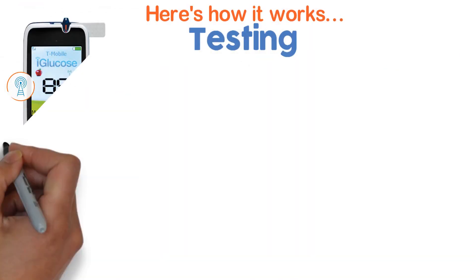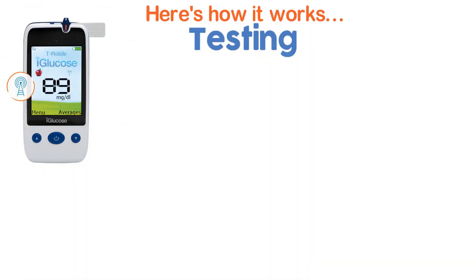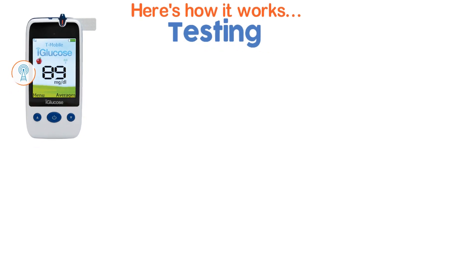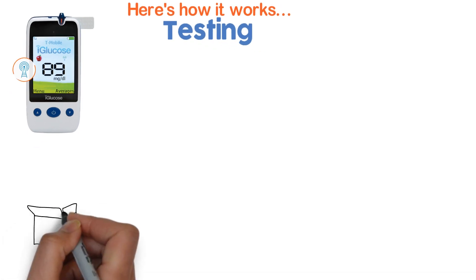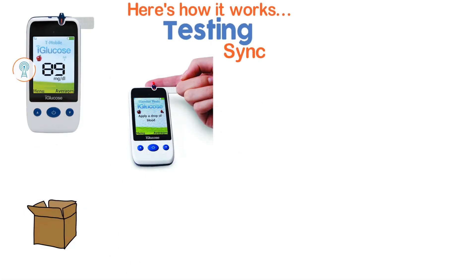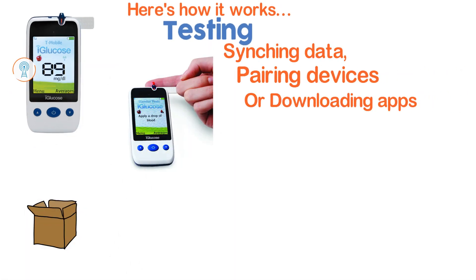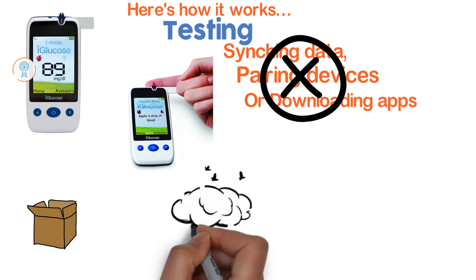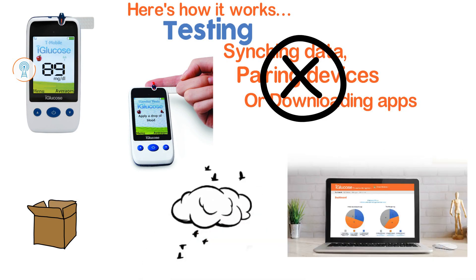You use a cell-enabled iGlucose blood glucose meter. Right out of the box you can check your blood glucose and a result is sent to the cloud.